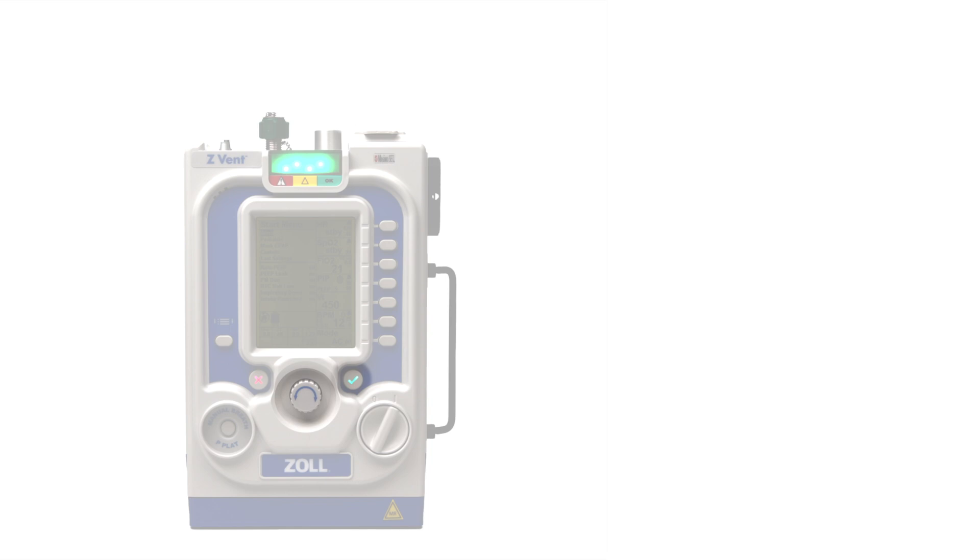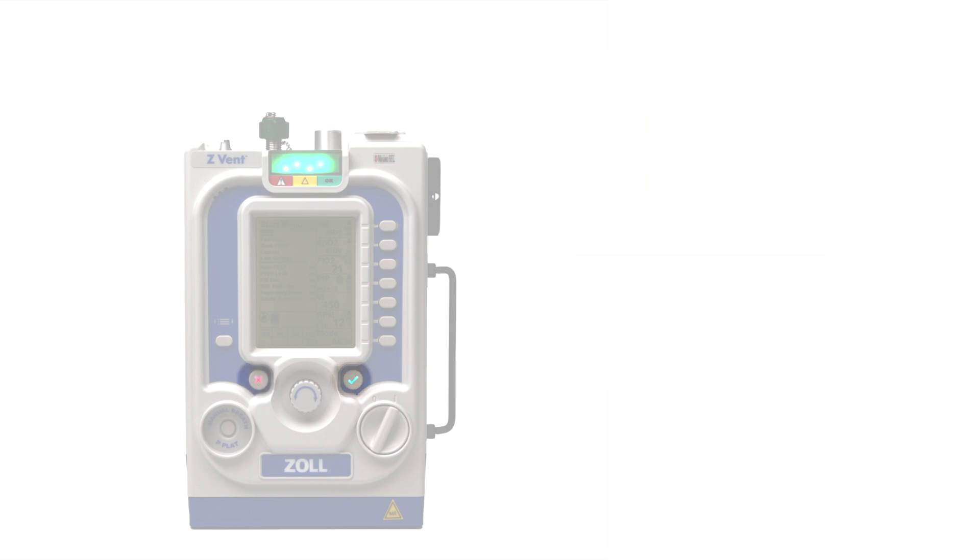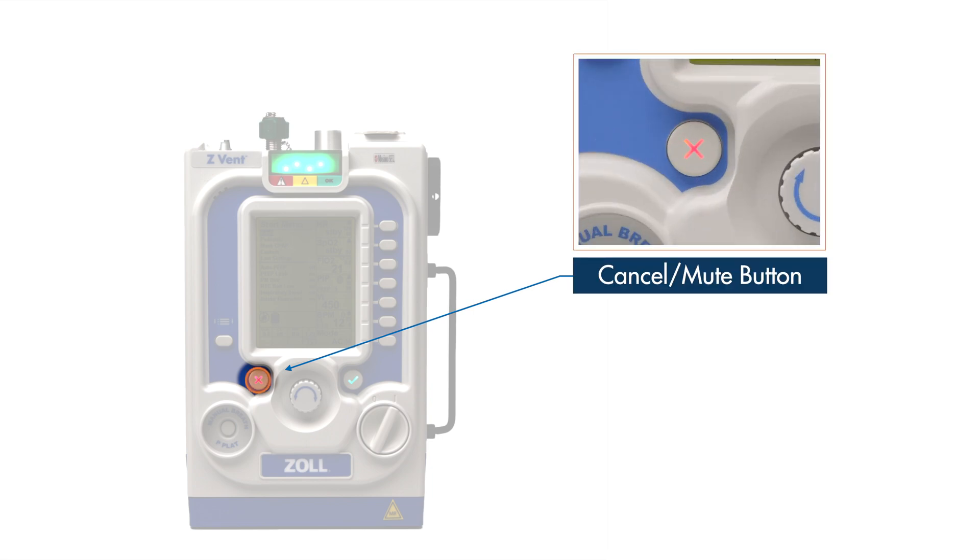Once a parameter is chosen and the value set by the selection dial, the user may confirm the changes with the accept button notated by the checkmark icon. This button also allows the user to acknowledge pop-up messages or select menu choices. To cancel a parameter selection or go to the previous screen in menu navigation, press the cancel button notated by the X icon. This button also enables the user to mute audible alarms for 30 seconds, allowing time to resolve the error.